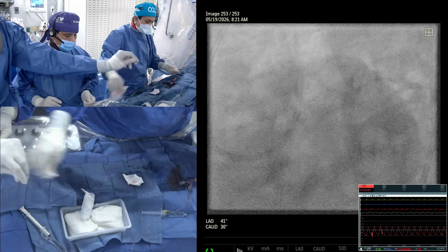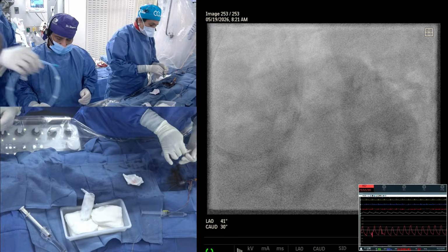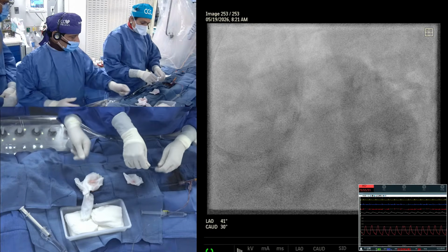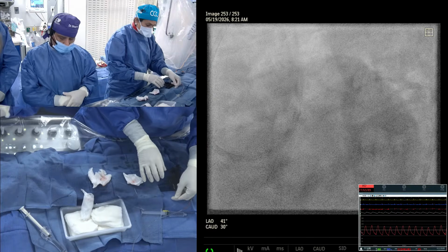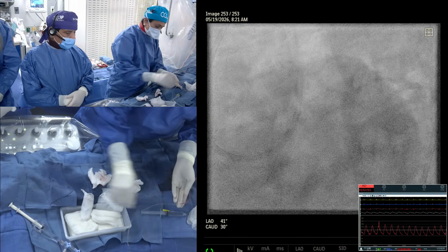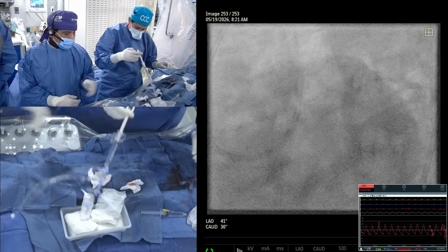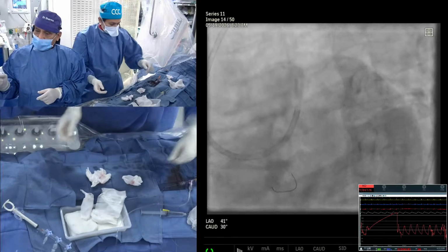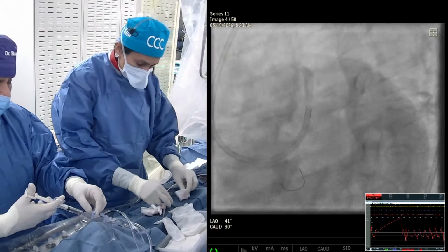Yeah. So extra support mostly with true ostial disease of the RCA, where your guide is actually not in the vessel, what I call zip lining. Zip lining rota, where you have the guide not engaged, you're far away, and rota has to go on the wire without engaging the guide in the vessel. That we call zip lining. In that situation, yes, you need extra support, definitely. So a very simple answer would be that, as Anu mentioned, in aorto-ostial, extra support is reasonable. In non-aorto-ostial, I think it should be floppy because extra support can cause significant wire bias in one way versus the other.